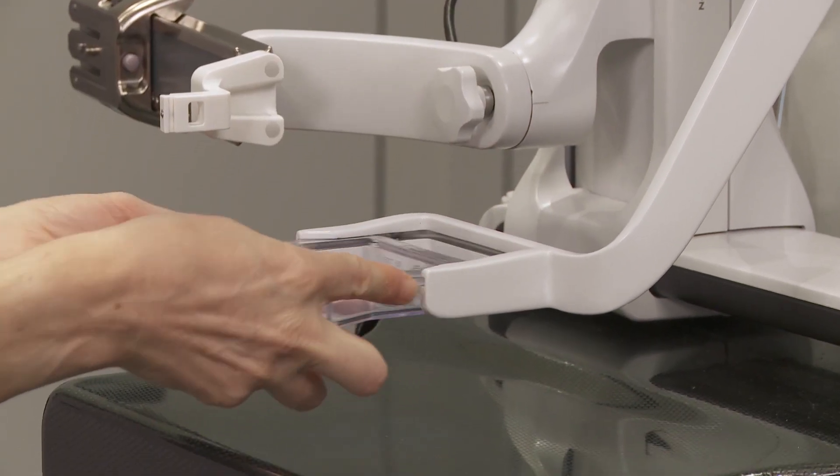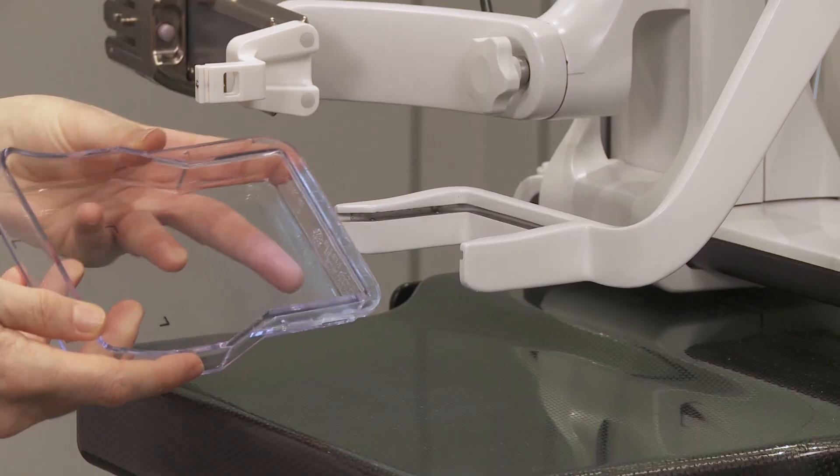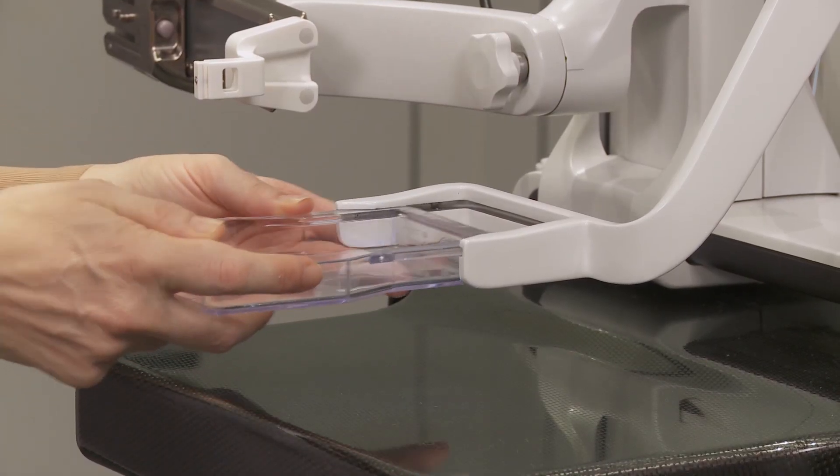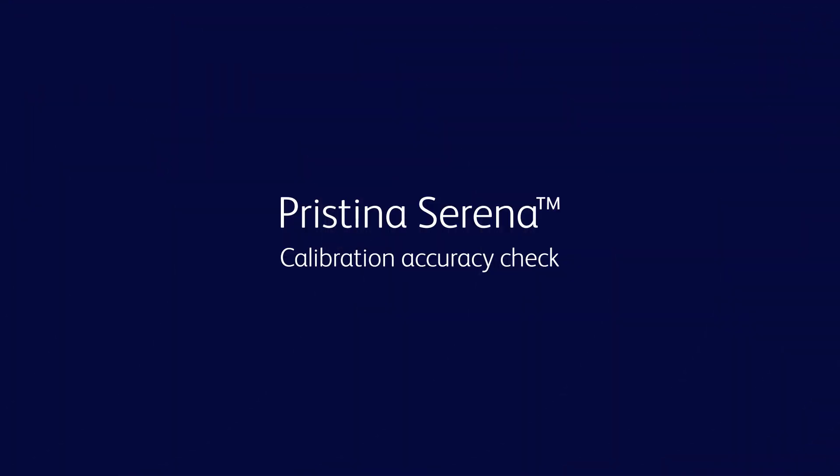Remove the biopsy plate with aperture and attach the one without aperture. Calibration accuracy check.